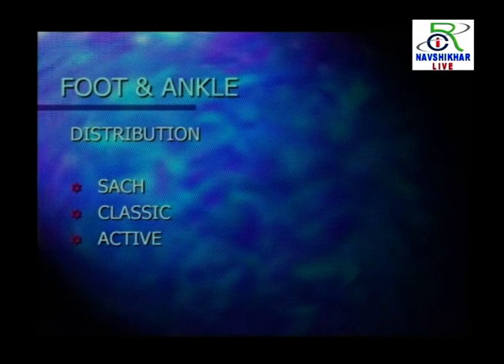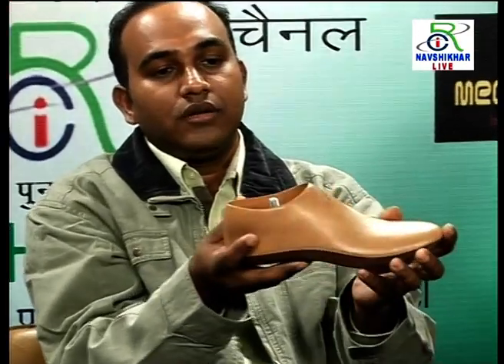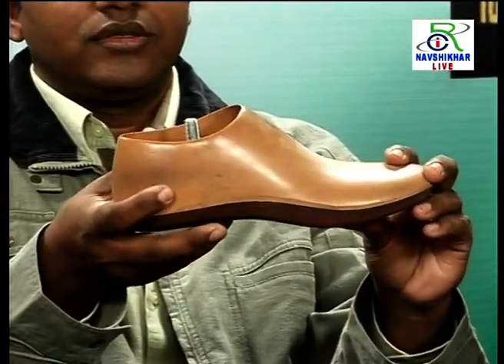In the foot and ankle system, unlike the upper extremity, there is a lot of variety and many concepts available. Nowadays in the market, at least 50 to 60 kinds of foot and ankle systems are there. In the same way, in the transtibial system, the foot systems I'm showing you right now are the basic, normal SACH foot kind of things.